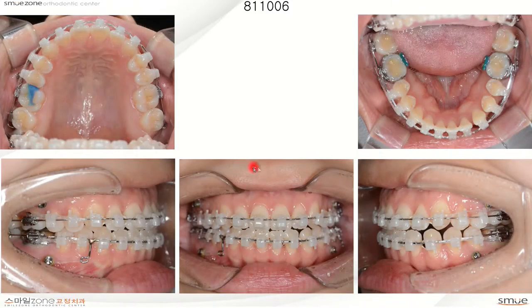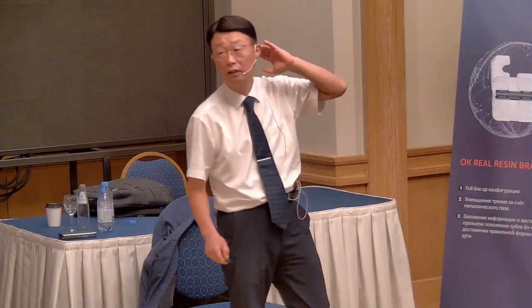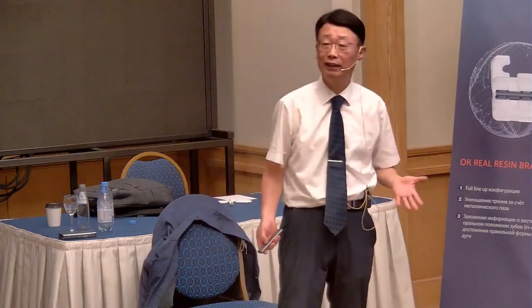At the same time, we retracted this upper left side a little bit and everything went on, and then we asked them to wear class 2, class 3 elastics as needed.